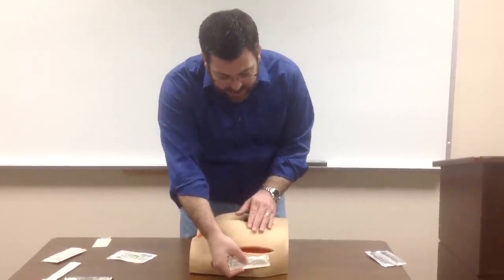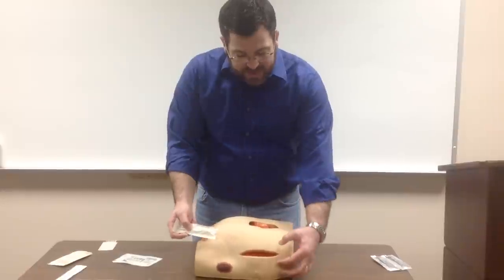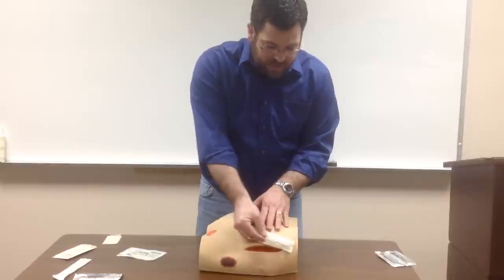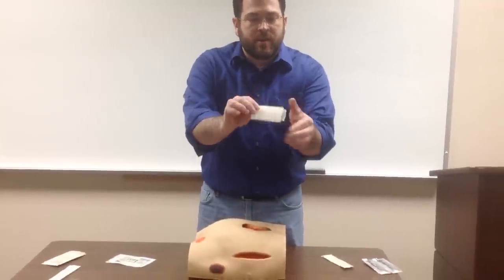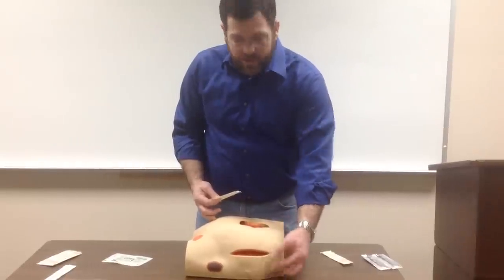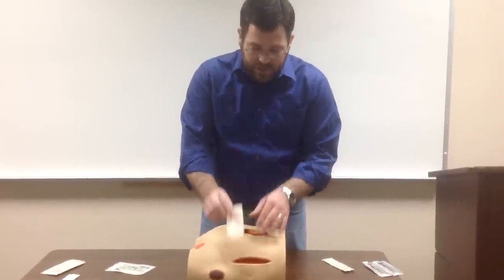What you're going to do is take the tincture of benzoin, open it up, and paint — not right up to the wound edge, but as close to it as you can get without getting any into the wound — on either side of the wound. Because what I want is a nice sticky surface for my steristrips to stick on. You can see YouTube videos on this if it's not making sense. You're just going to rub it on here and it will dry very tacky. Once I've done that, I'm going to take my steristrips and find the right length. You can get them longer or shorter, but you want as much space on either side of the wound as you can get, because the more surface area covered by steristrips, the tighter it's going to hold. I would not cut these — find strips that fit the size you need and use them.